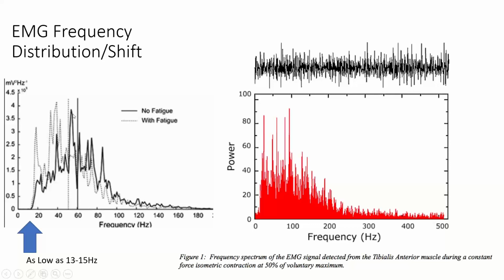And then if they do that for too long, fatigue sets in, and then you can see what happens. The frequency distribution shifts down to lower frequencies. So the lower the frequency of your EMG, the more you're in the 15 to 20 hertz range, the more the possibility that it's muscle fatigue. But it also creates a problem. Identifying the stratification can sometimes be tricky, because a muscle group will shift its frequency range as it fatigues. So now we get to think, wow, this gets so complicated.